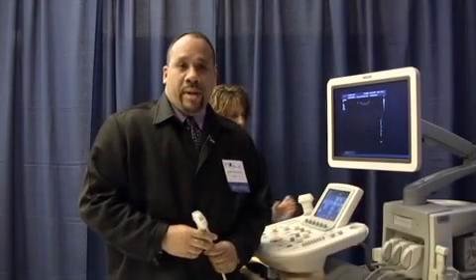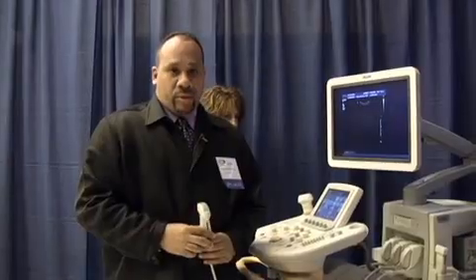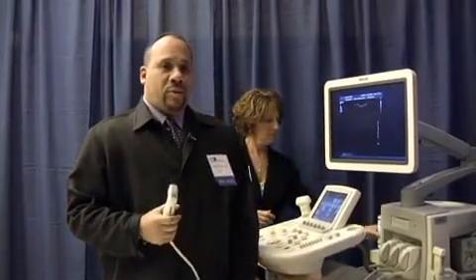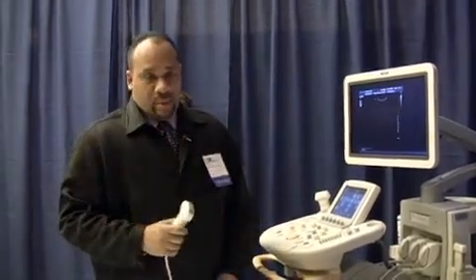My name is George Berdejo. I'm the Director of Vascular Ultrasound Services at Medical Center in New York City. And today I'll be demonstrating the use of duplex ultrasound to image the arteries from the level of the aortic bifurcation down to the tibial arteries.